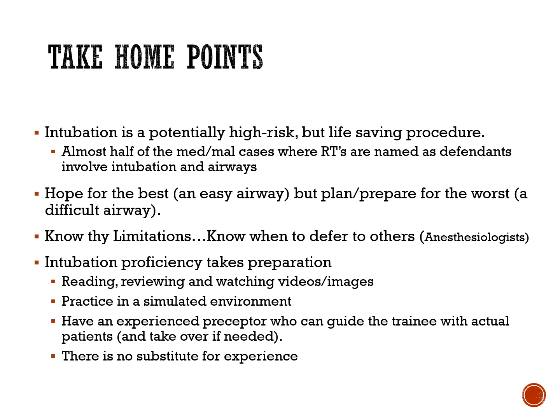Hope for the best. Again, 80 or more percent of intubations are relatively straightforward for the experienced intubator, but prepare for the worst. Have a difficult airway box or bag available. Know your limitations. Like I said a little bit earlier and elsewhere in this presentation, know when to defer to others, such as anesthesiologists, in order to do the intubation.